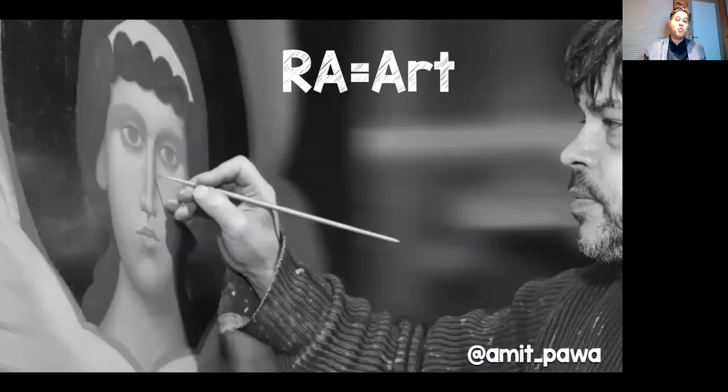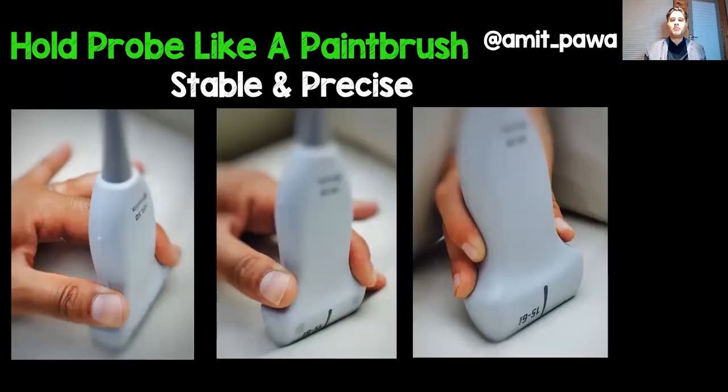Regional anaesthesia is a form of artwork. Certainly, I think it is. So therefore, when you're holding your probe, treat it like a paintbrush. You'll see that I opt for the two pictures on the left. I opt to use my pinky finger as a tripod, so I can use my finger to stabilize myself against the patient. But if you've got slightly smaller hands, and again, the picture on the far right here is my eldest daughter now, she was 6 at the time, her hand holding a linear probe. That's a decent sized probe there. Hold the probe low down. Keep it nice and stable and brace yourself against the patient's skin. So hold the thing that you're going to be using to create these beautiful images like a paintbrush.